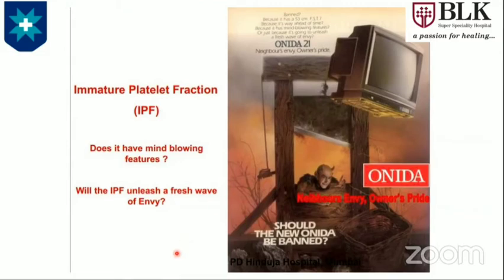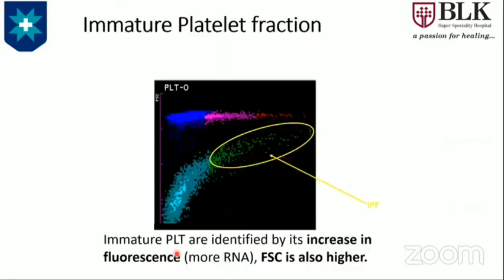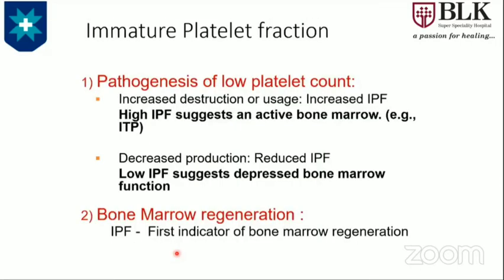And eventually I got this immature platelet fraction on board and we tried to work on it. And this is how the immature platelet fraction actually started giving us a lot of information, which was helpful not only in our routine practices, but especially in dengue. I'll just show you a few of the cases where IPF becomes extremely important.